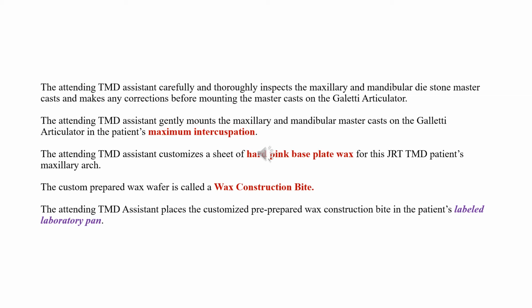And you need to be able to use these lab pans. The labels are in commonly asked questions under forms, and then so go and look at them, print a few out, understand what the labels say.